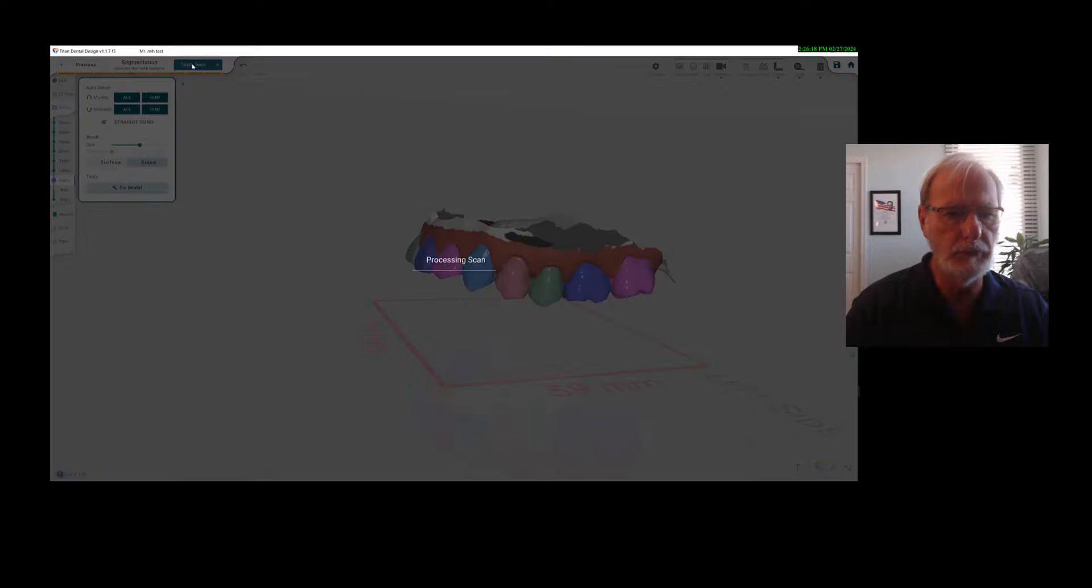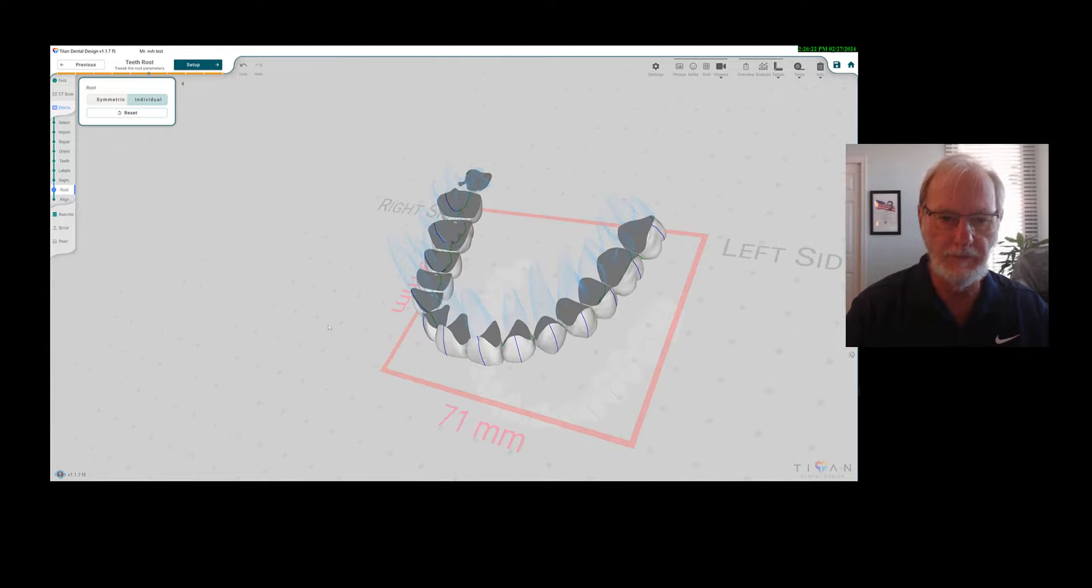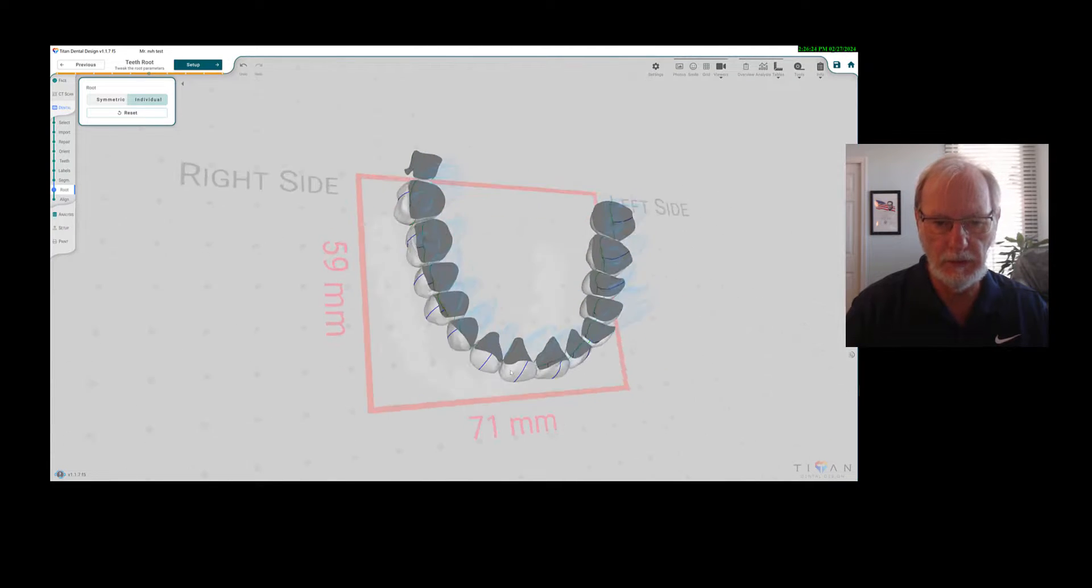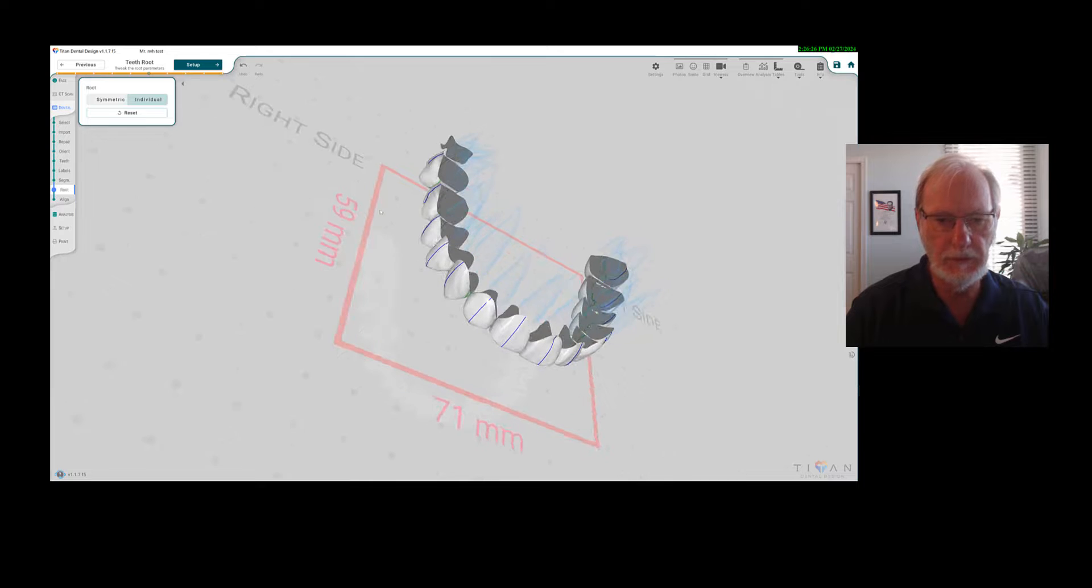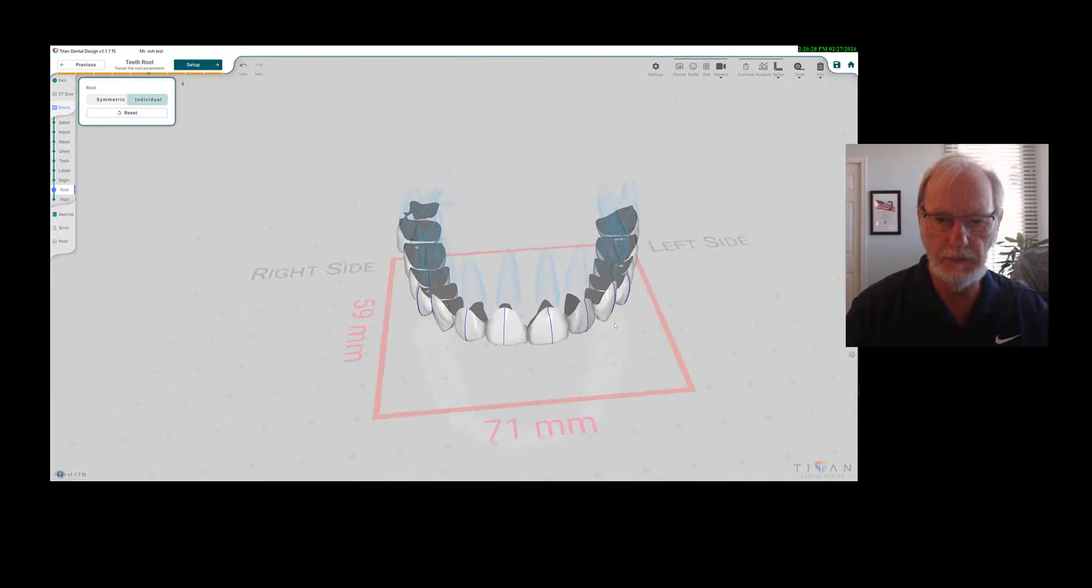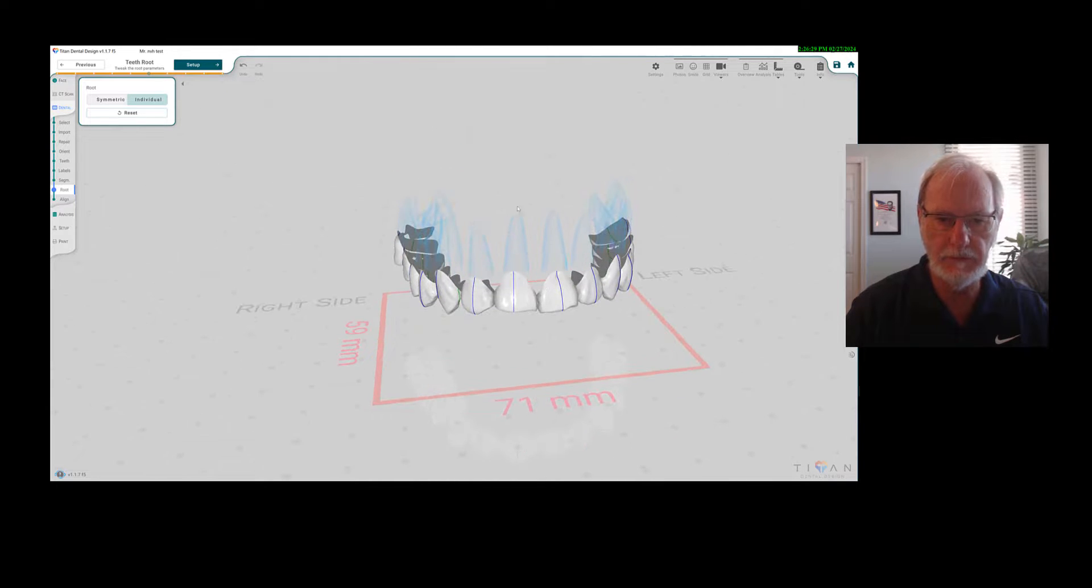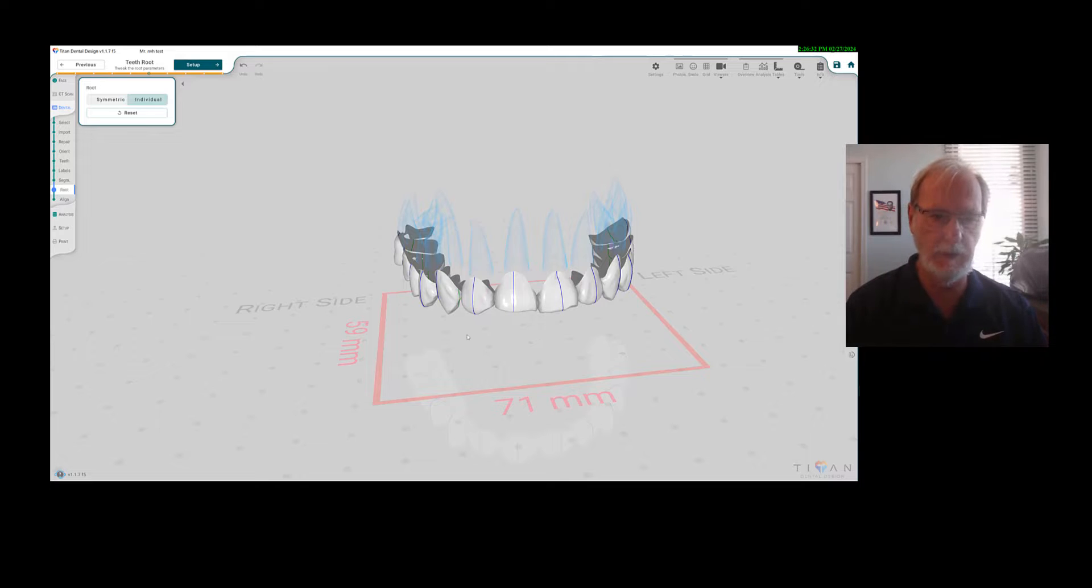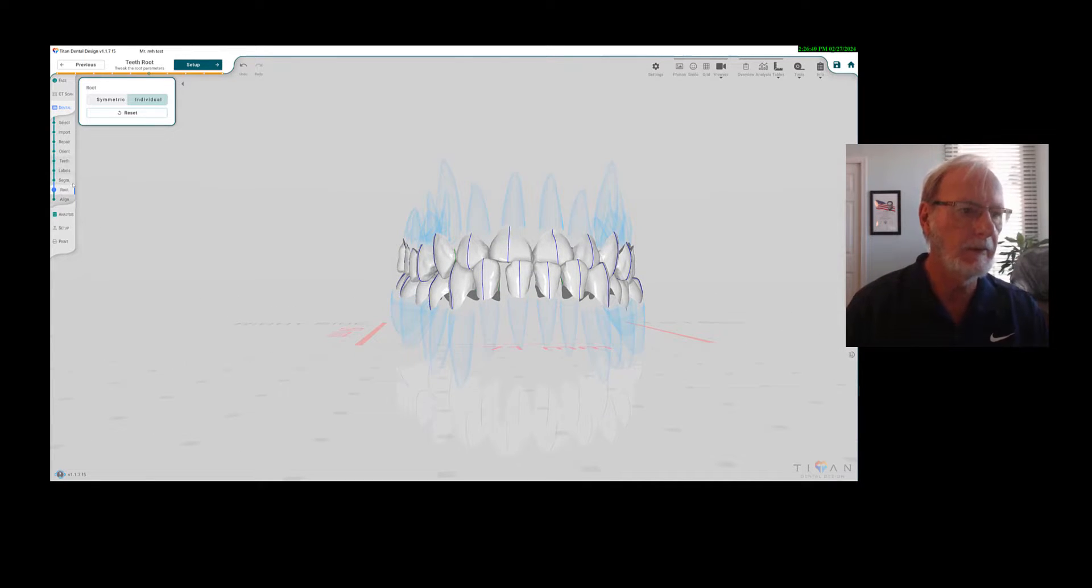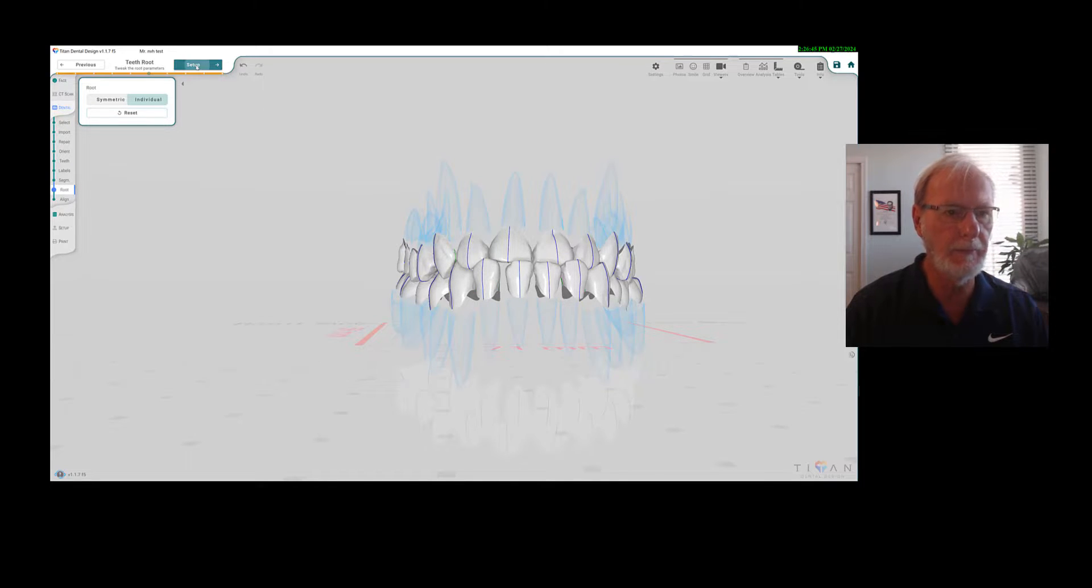Then you can add the roots of the teeth. Right here, you can see them. They are fake roots, obviously, and eventually we'll get the cone beams to work with the roots, but these are the average root size in relation to the crown size. We'll add the lower too, and then you get to go to the setup.